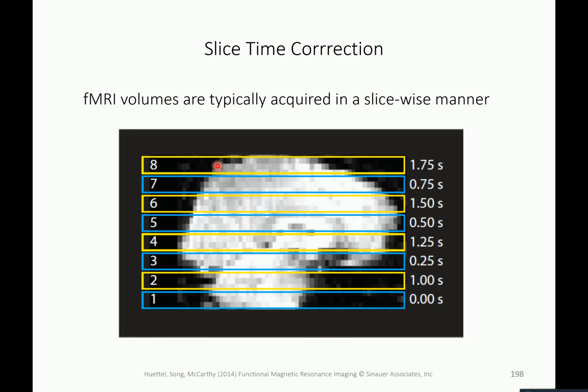I don't know, from your fMRI papers, I know you're not reading fMRI papers, you're somehow reading all sorts of papers, but not papers that actually have to do with fMRI or EEG. But does anyone in their fMRI paper come across 3D imaging, one-shot imaging, or slice time correction? We came across slice time correction. Okay. Slice time correction was there, good.